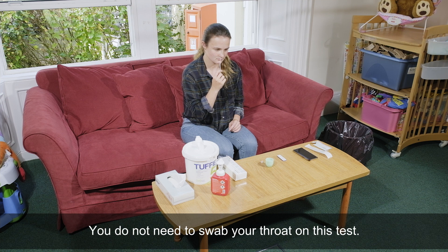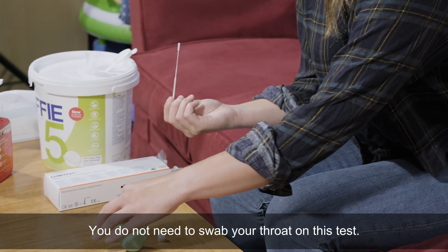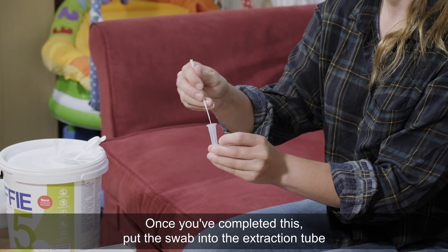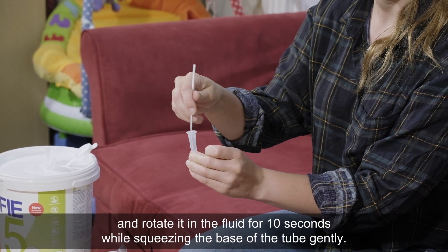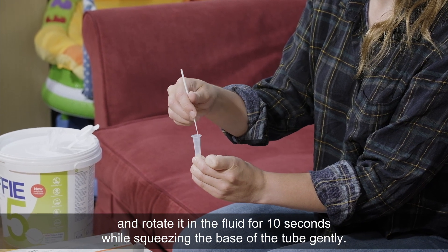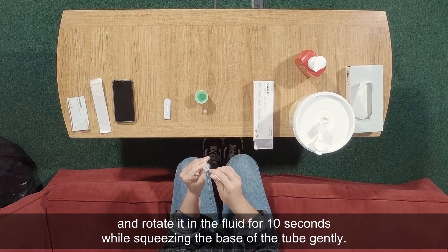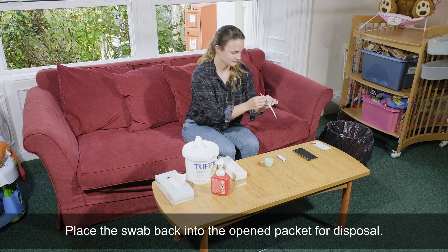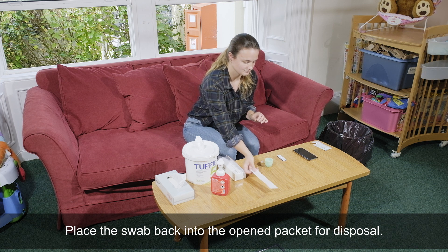You do not need to swab your throat on this test. Once you've completed this, put the swab into the extraction tube and rotate it in the fluid for 10 seconds while squeezing the base of the tube gently. Squeezing the tube, remove the swab. Place the swab back into the opened packet for disposal.